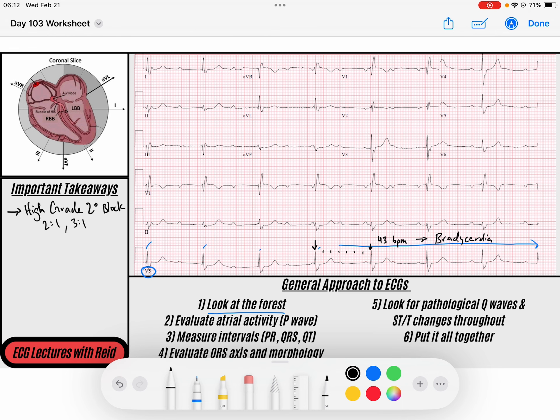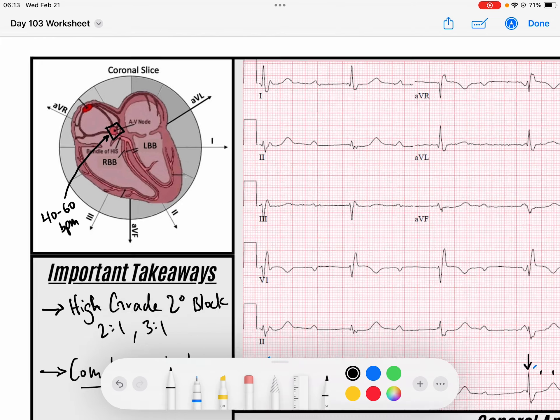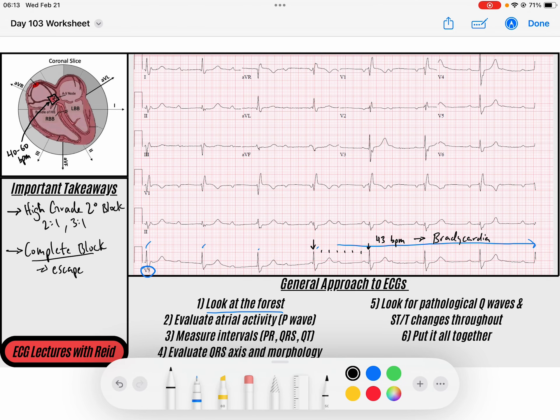With a high-grade second degree block, you'd have double the amount of P waves compared to QRS complexes. I also want you to think of a complete block. In a complete block, we would need an escape rhythm. We know that escape rhythms, especially if they arise from the AV junction, escape at a rate of 40 to 60 beats per minute. I tell you to rule these out because these are both high-risk diagnoses where someone can die if you don't treat them.